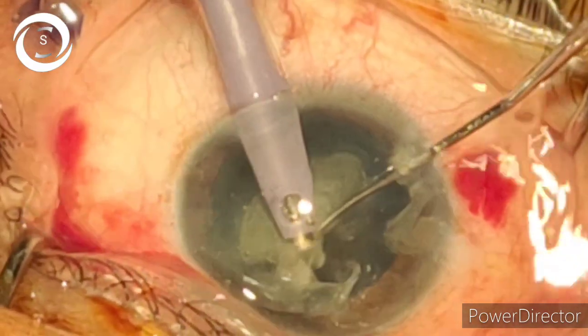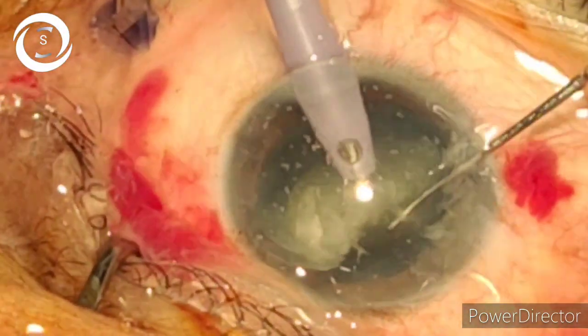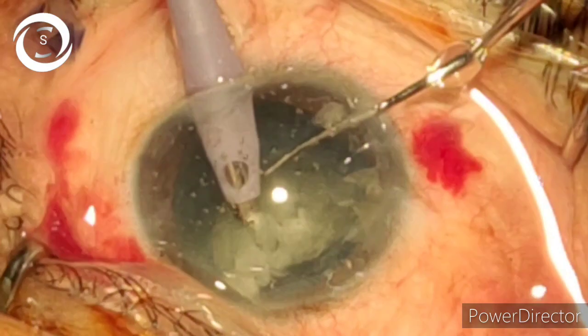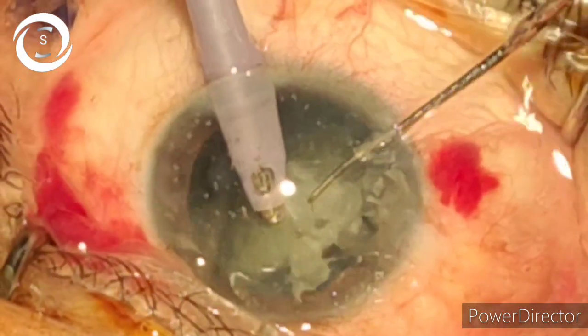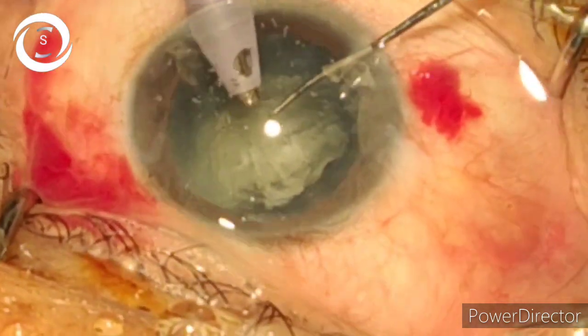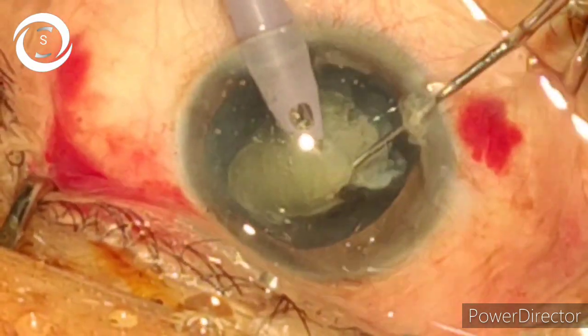To constantly elevate the nucleus with the phaco probe, you need to have sound control of the foot pedal, because in my modified tilt, rotate and chop technique most of the gripping is achieved in vacuum — the second foot pedal step. If you don't have sound control and press the pedal further, phaco will start and the nucleus will fall.